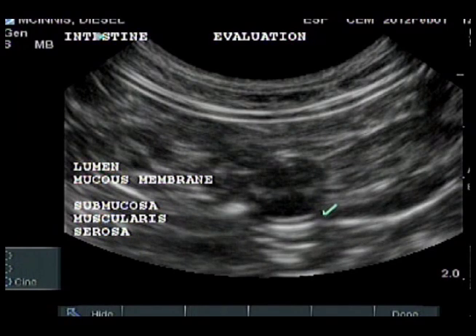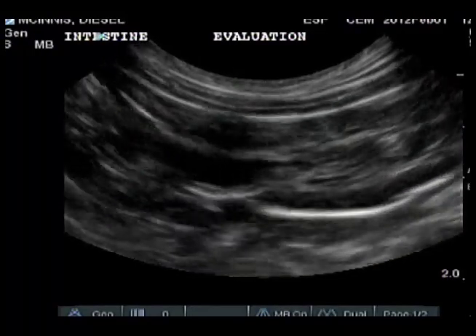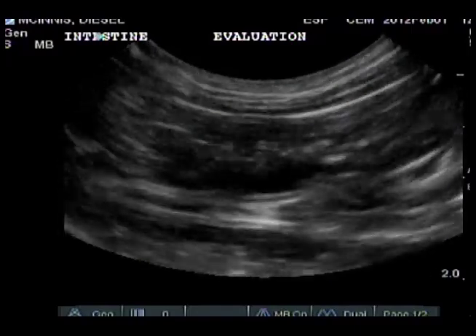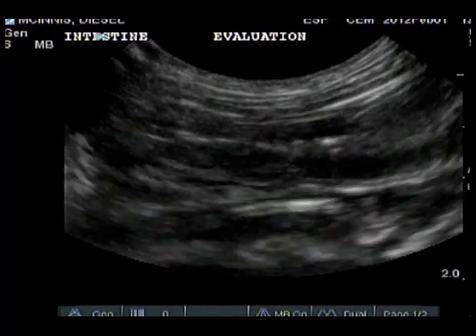If the patient has not been fed in 12 hours, the intestines are expected to be empty. Intestines usually contract 1 to 3 times per minute, and the peristaltic motion should be in one direction. You should not see abdominal effusion or mesenteric lymph nodes.